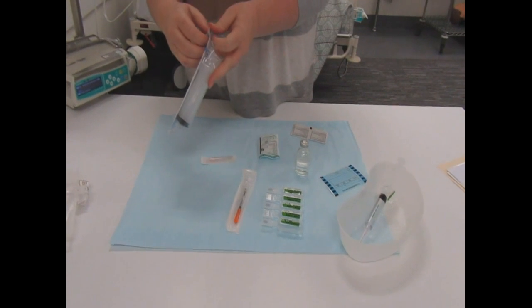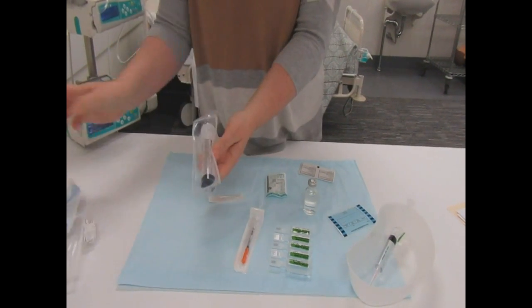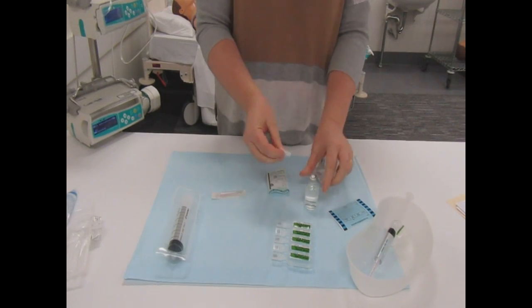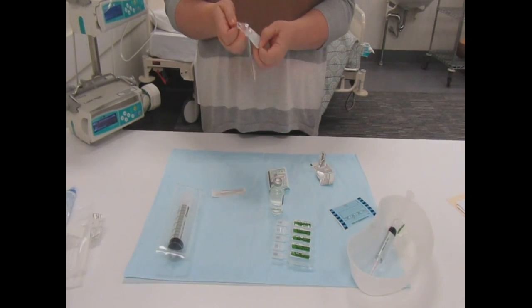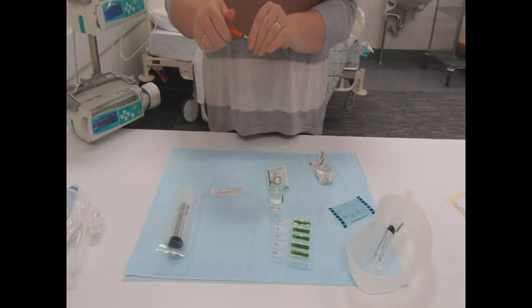I'll open up my 50ml syringe just to get it ready, but remember to leave it in the packet so that it stays sterile on the bench. Before I open my insulin syringe, I'm just going to swab the top of the ActRapid, because it's been open in the cupboard and we don't know who's put their hands on it or what's been next to it.